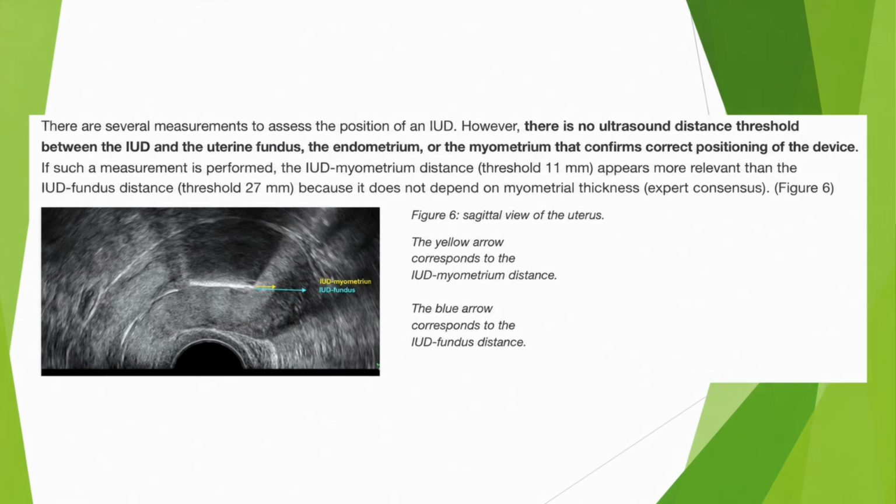And if you reach that margin or have any doubt, I think it's essential to refer, in that case, to a specialist who can maybe double check the measurement, this time using the transvaginal route so as not to pose any risk to the patient, whether it's the risk of complications or the risk of pregnancy.